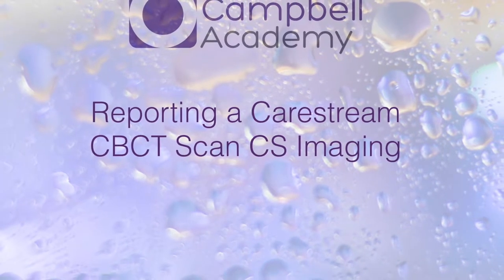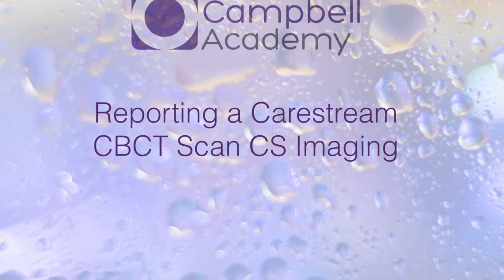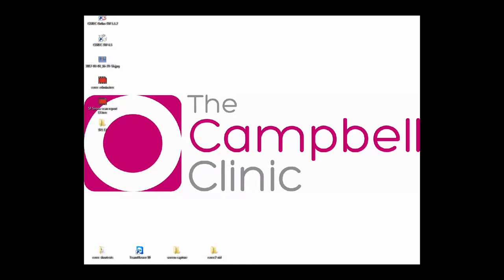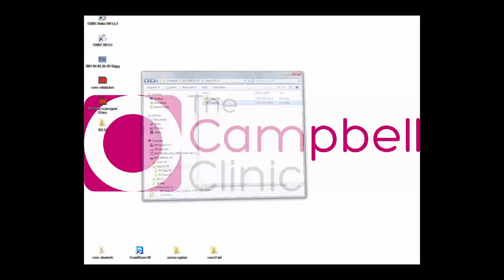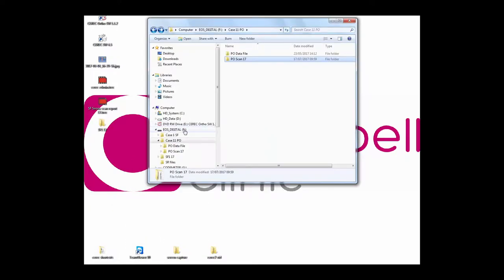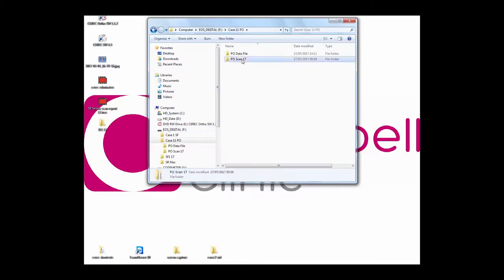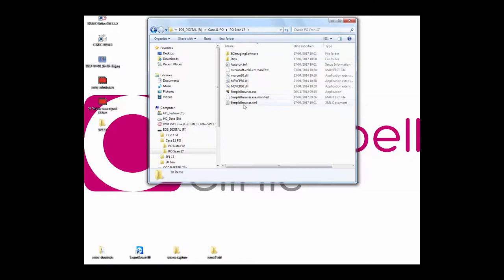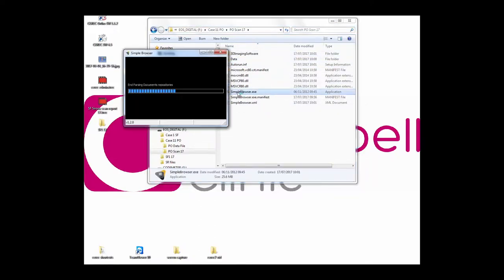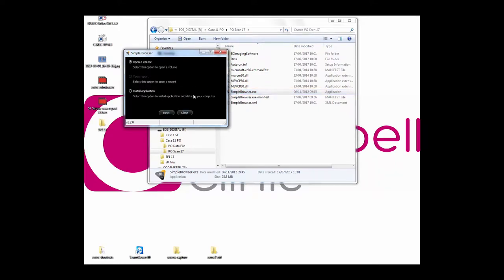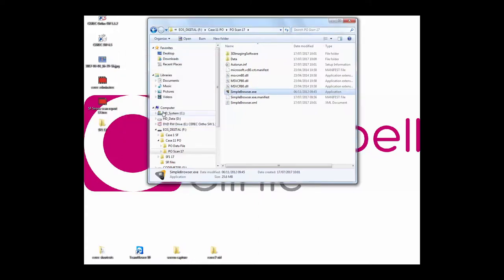To open the scan you need to access the file on your computer using Windows Explorer — this should be Windows 9 or 10. Once you access the file you can pick the specific patient scan file from the media it's on, and when you open this up there will be a setup file. Look for the CareStream setup file in the simple browser and click this. This should open the software where you'll be given the choice to either install the viewing software or to open a volume.